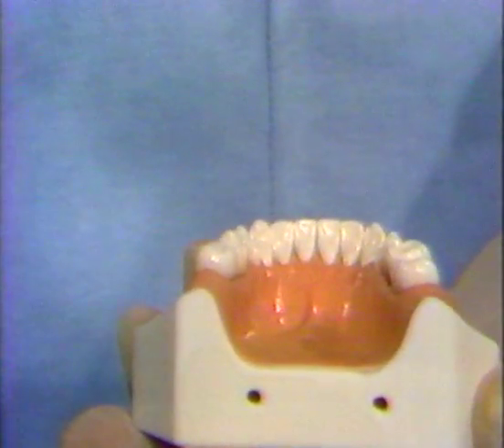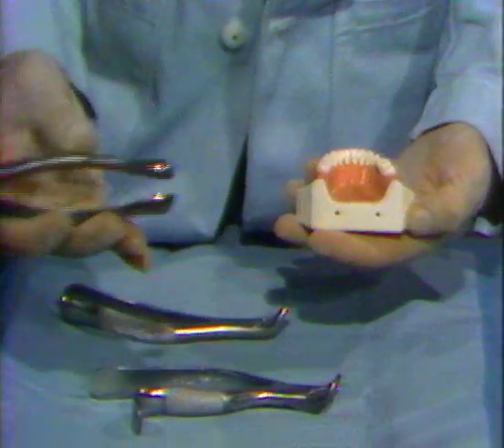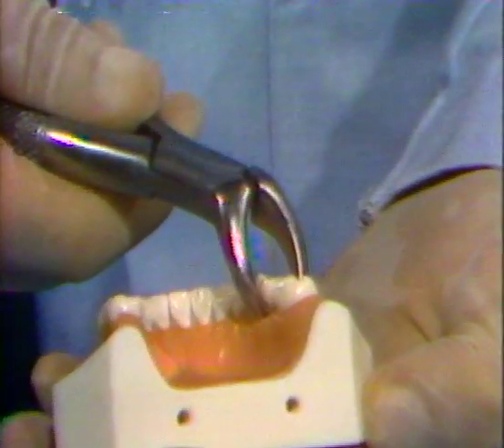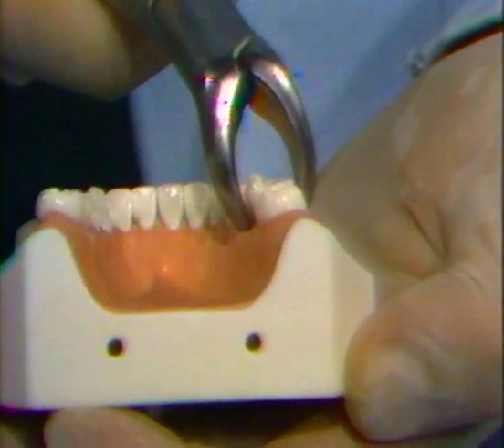For the cowhorn forceps, number 16 has a curved handle, the number 23 a straight handle. Place the lingual beak at the lingual bifurcation, followed by placement of the buccal beak in the buccal bifurcation. Make certain the mandible is properly supported before initiating the movements for tooth removal.